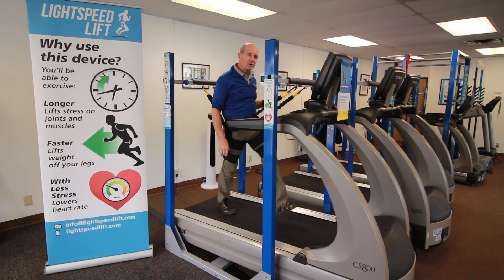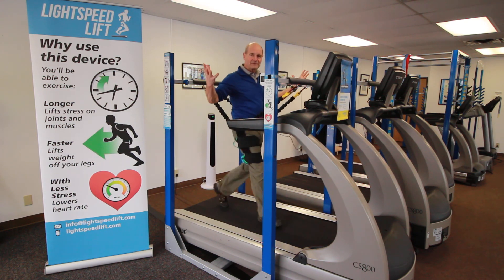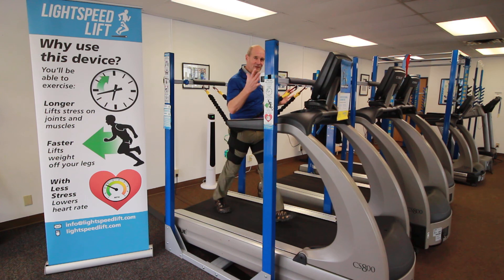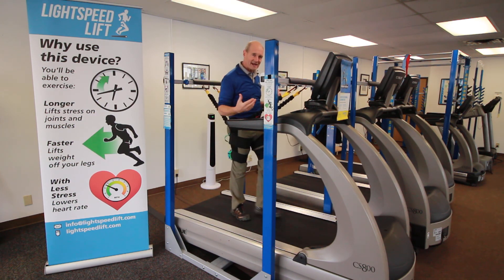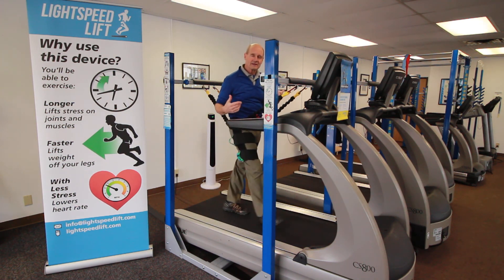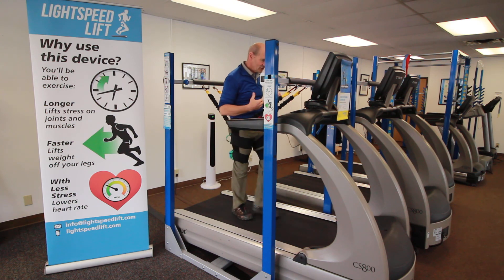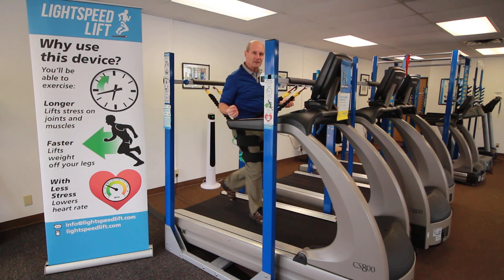I can do marching maneuvers. Life is lived on all three planes. It's nice to get people relaxed and moving. The belt has just enough give that you get to experience a loss of balance but not quite lose it.